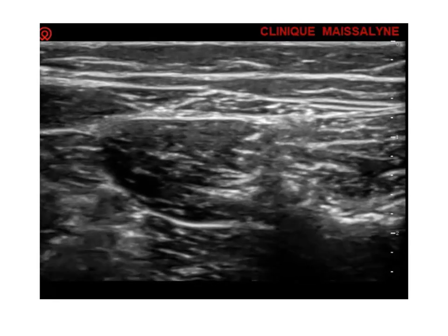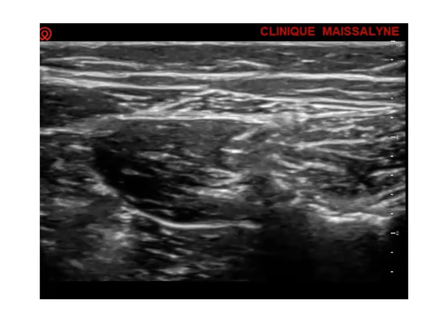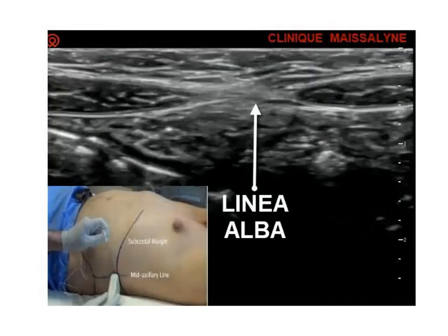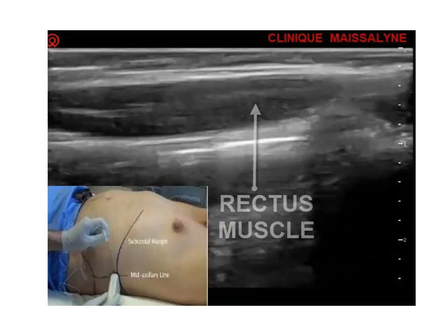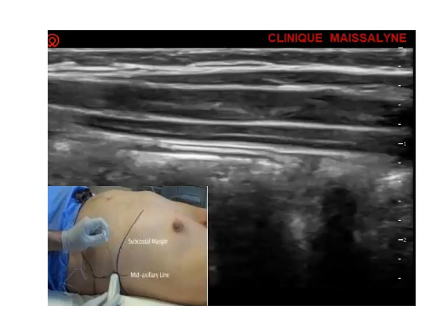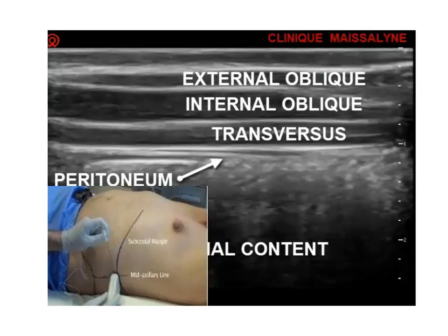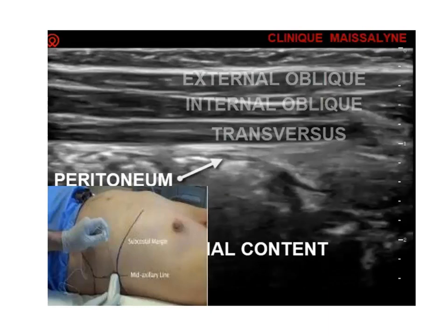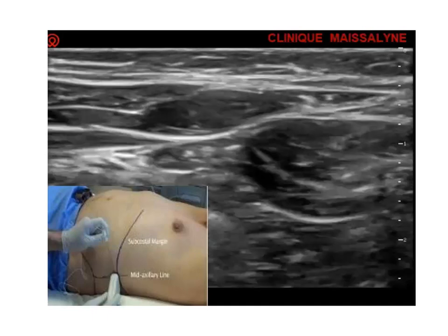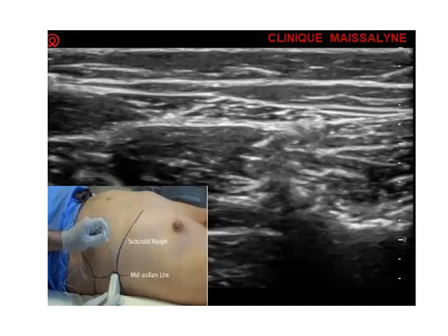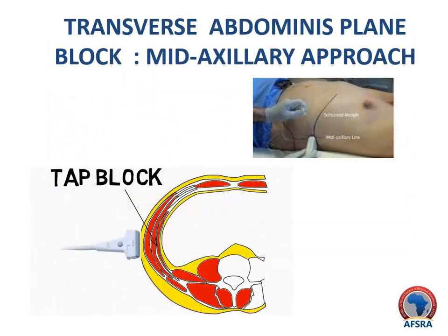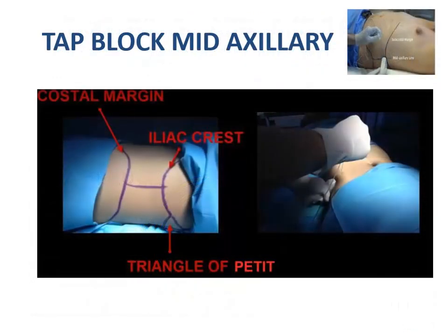In the midaxillary approach, the TAP is identified close to the midaxillary line. The transducer should be placed in the midaxillary line between the iliac crest and the subcostal margin. The transversus abdominis layer is usually the most hypoechoic of the muscle layers, with the external oblique muscle being the most superficial. Tilt may be applied to the transducer to better visualize the fascial layers. The needle is advanced into the TAP and local anesthetic is injected using an in-plane needle technique. Injection of the local anesthetic into the TAP separates the muscle layers.